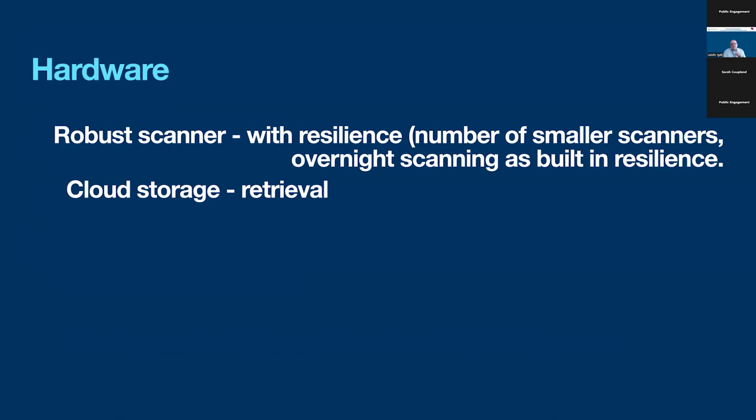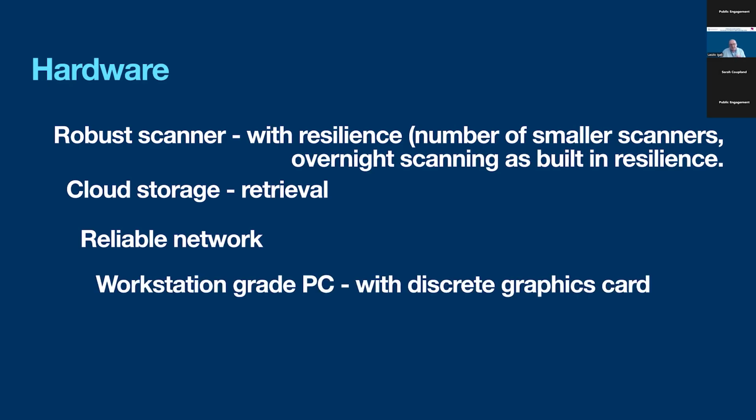Cloud storage is very important, but be aware of the retrieval times. Reliable network, I cannot emphasize it enough. You have to have a significant amount of bandwidth. Fiber optic is almost essential. Workstation grade PCs are also important. We don't get recognized by the IT departments. A discrete graphics card is almost essential for digital pathology. Yes, you can do digital pathology on a tiny screen, but you can't do it on a big screen without a discrete graphics card.